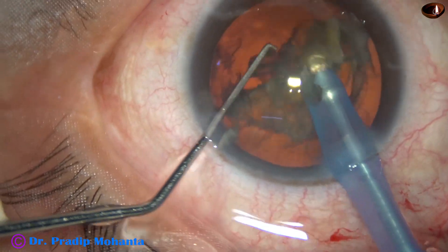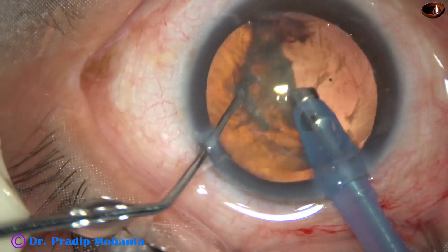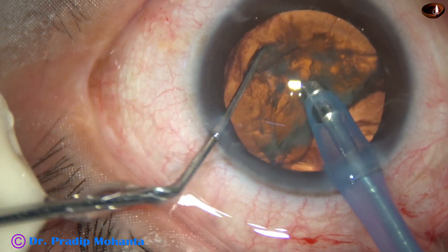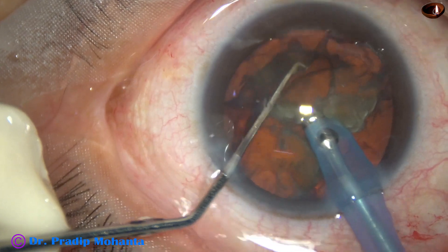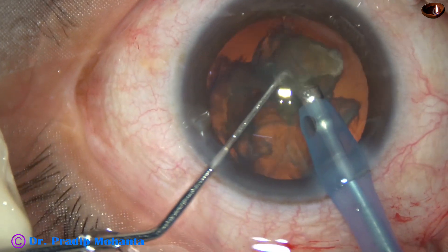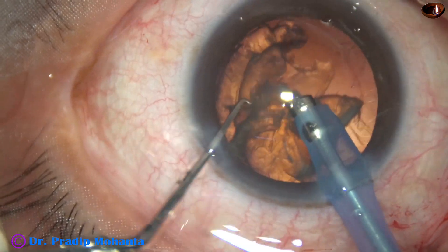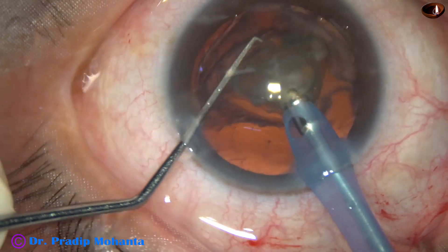Go to the next piece and emulsify that piece also. Now rotate this hemi-nucleus and divide it into two halves. Ultrasonic energy in this case is 60%, flow rate is 45 ml per minute, and vacuum is 450 mmHg.